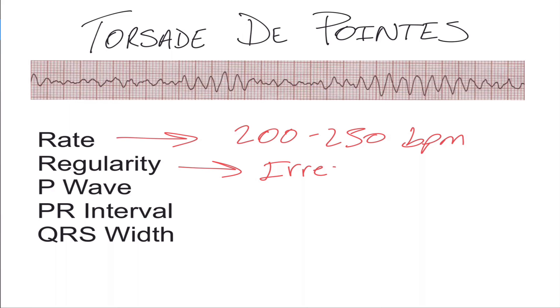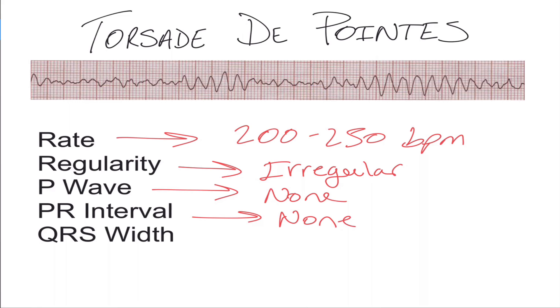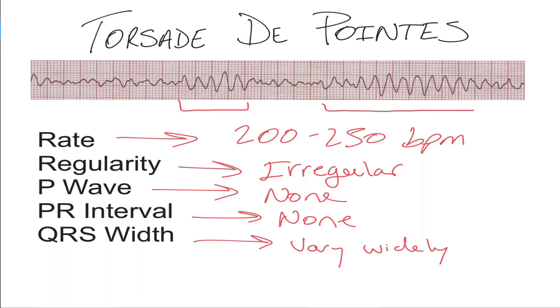The rhythm itself is irregular, there are no P waves and therefore no PR interval, and the QRS is going to vary widely. As we look at the rhythm itself, we see these changes from small complexes to big complexes and everything in between.